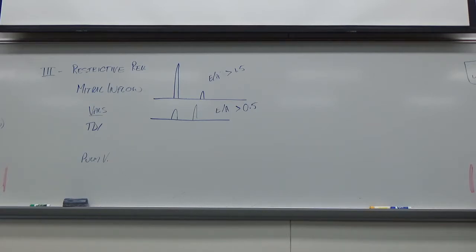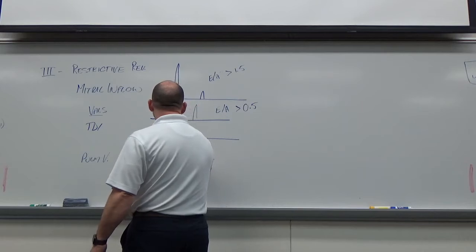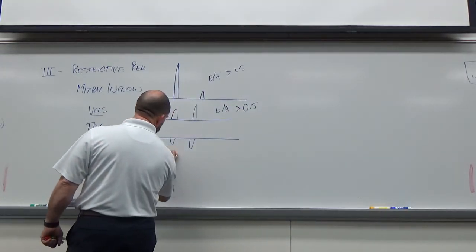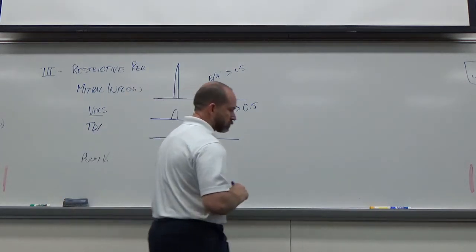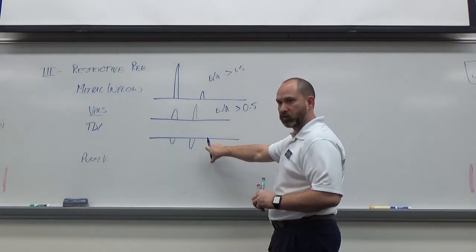Something like that. Okay, then tissue Doppler. I think all it said on tissue Doppler here was that this is less than 8, right? This is greater than or equal to 10. That's for E to E prime. Okay, so don't get lost on that, because the tissue Doppler velocity is less than 8.